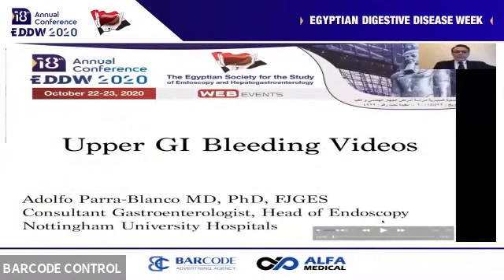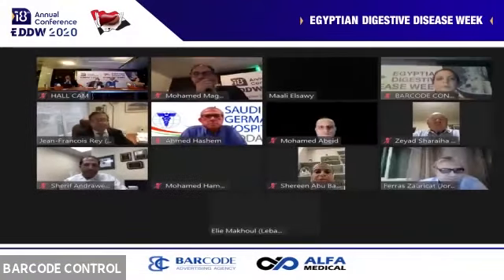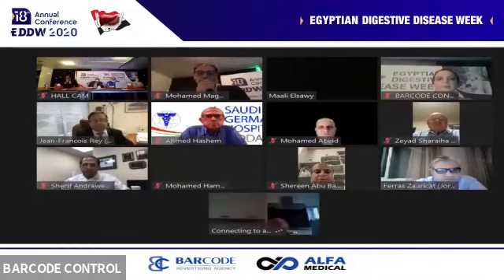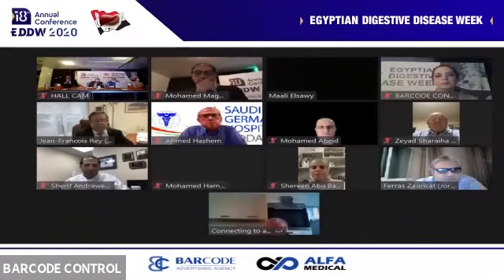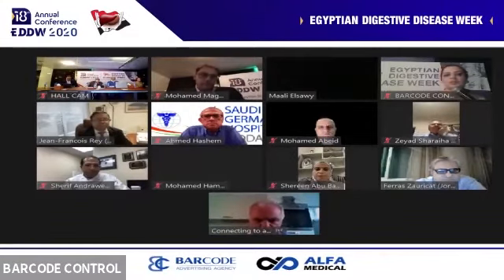Thank you, Dr. Maali. Dear colleagues, I would just like to give a comment on reporting, because I think we have a problem here in Egypt with proper reporting in endoscopies, especially upper. It is very important in reporting for all of us to speak one language, especially in description. It facilitates the follow-up of the patient.